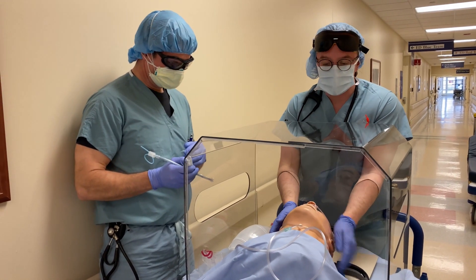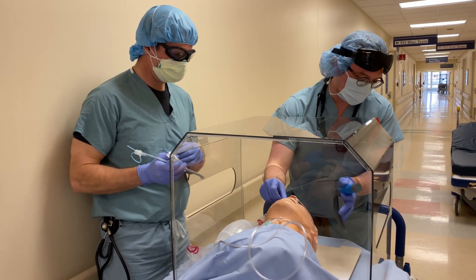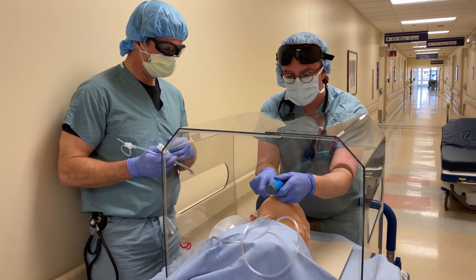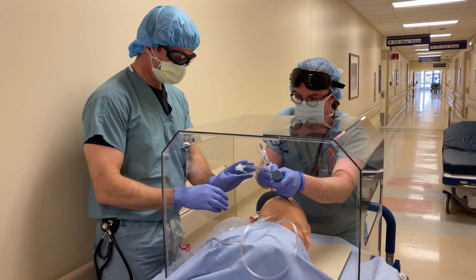So the intubation part — like any standard intubation, you position the patient how you want. This is designed to fit over the dimensions of the Stryker mattress that we have. Open the mouth. They can actually provide cricoid pressure if you need to.